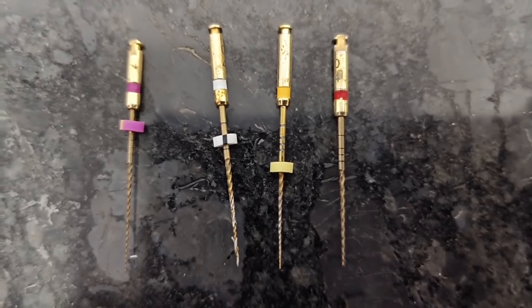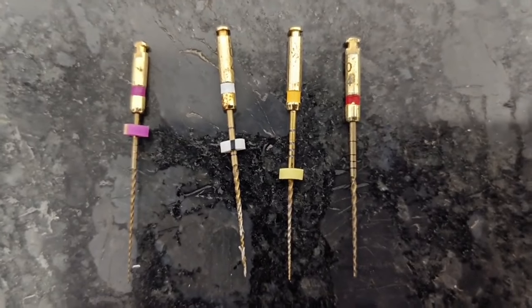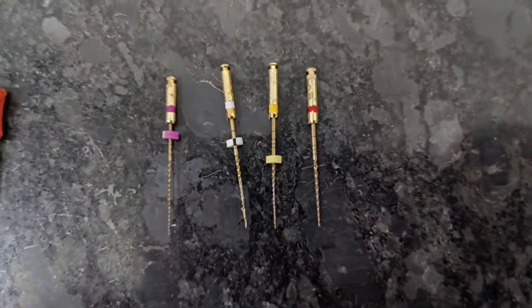Moving on to the rotary files, the purple file is the path file. The white color file is 4% 17, then the yellow one is 4% 20, and the red one is 4% 25 number file.